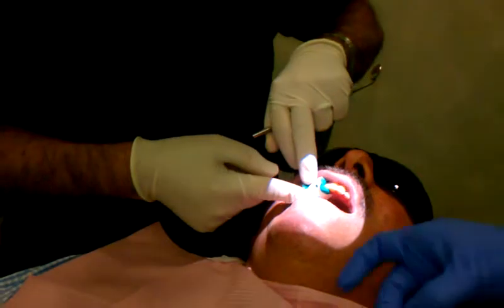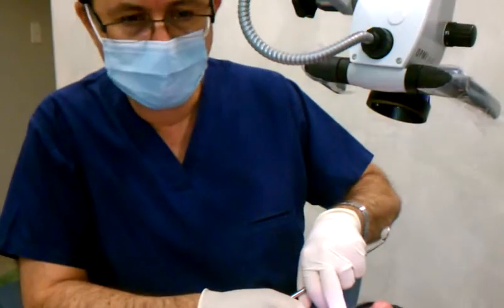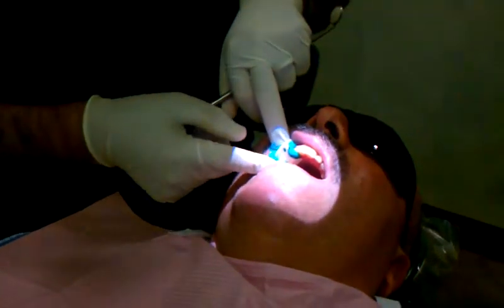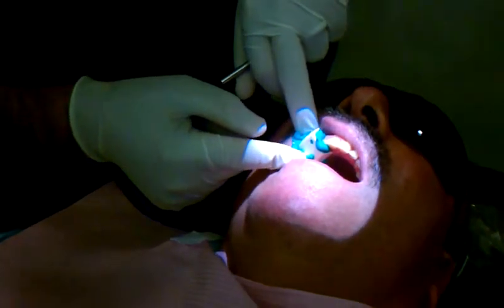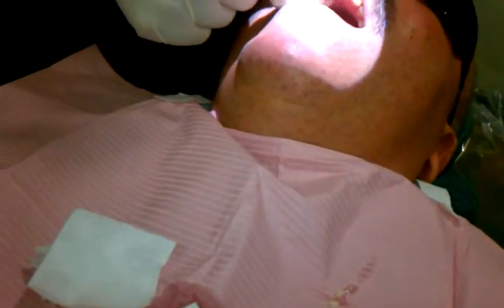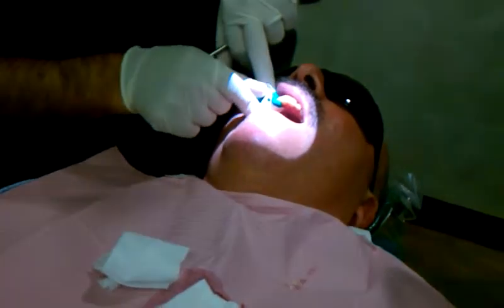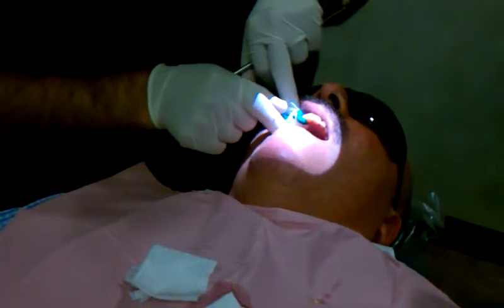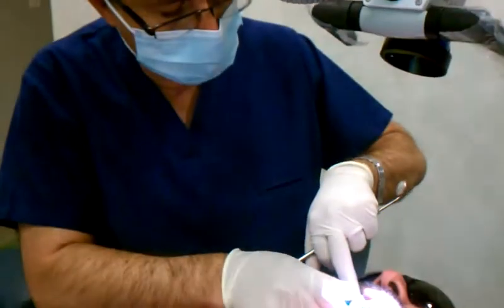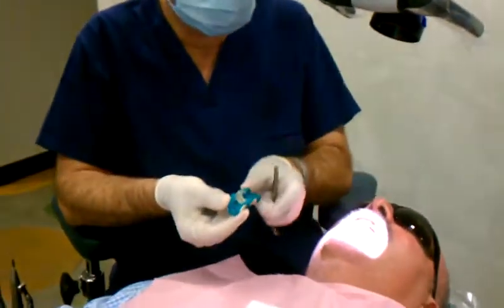Any time I have a root canal treatment being sent and I know that the crown is going to be changed and there's decay under the crown, I immediately take an impression and put it aside. Most of the time I do need it. When I'm done with the root canal treatment, I do the buildup, bring in the impression, do a rough prep under the microscope, make the temporary, and send it back to the referring doctor. The referring doctor has a lot less to do — the decay has been removed, the buildup is done, the root canal treatment is protected, and we know that the tooth is restorable.